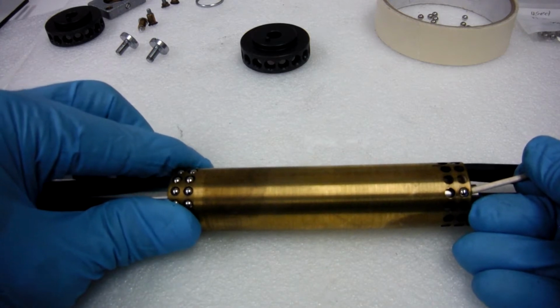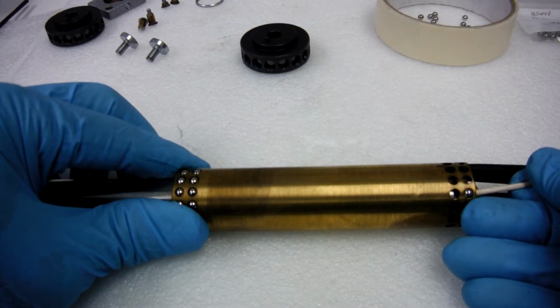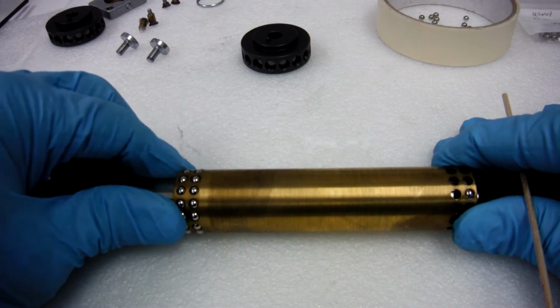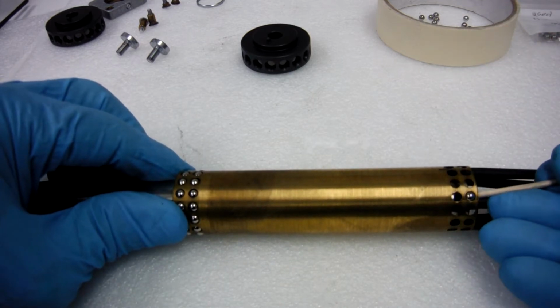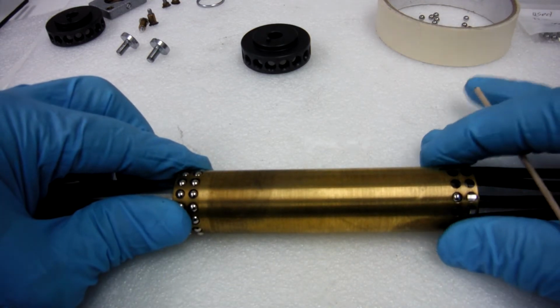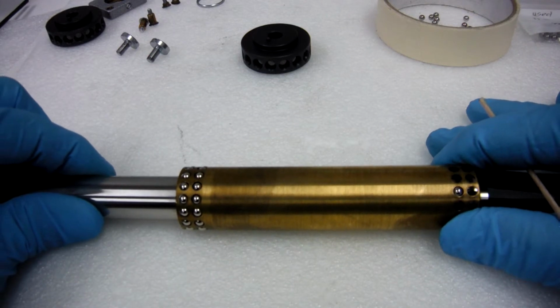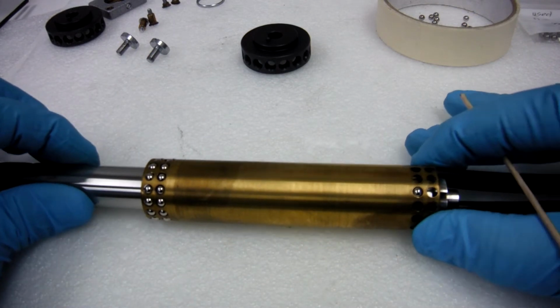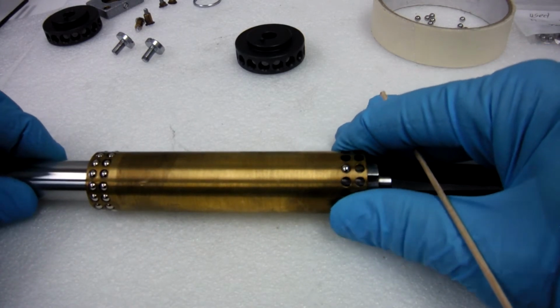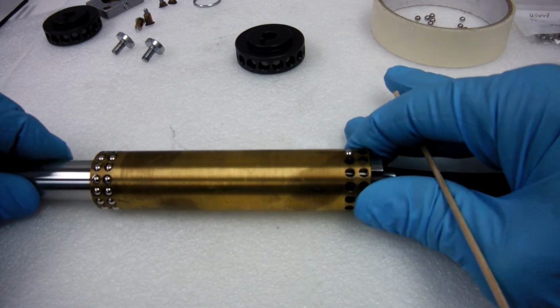We'll push our bearing track a little bit further so we can push our bearing into the second row. Okay, once you have your first bearing in, push the axle past, and then turn it. Turn it. We'll skip one. We'll do the next one.